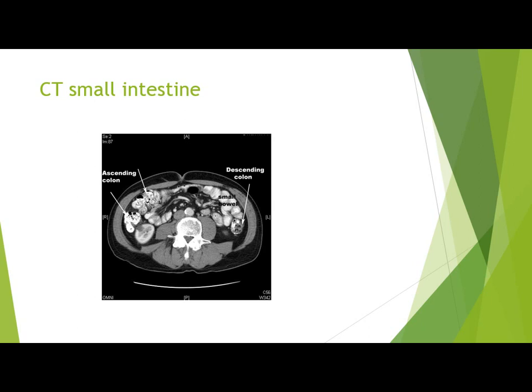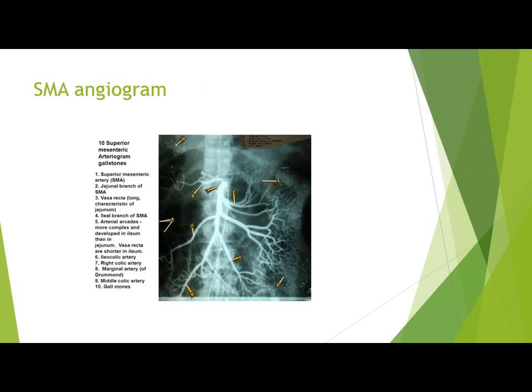You need to scroll through the images. If it is continuous, it's a ureter or artery or vein or whatever. If it stops, if it appears and disappears immediately, then it's a lymph node, most likely. Or a mass or a tumor or something.